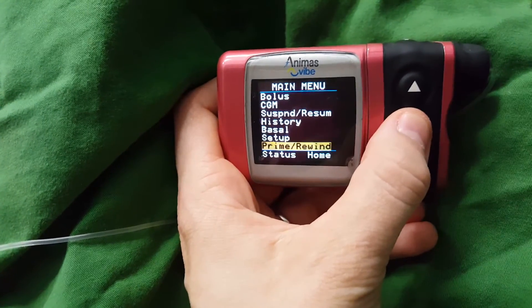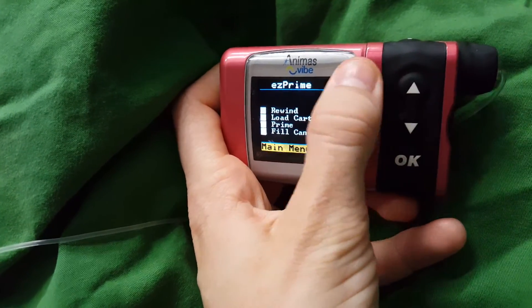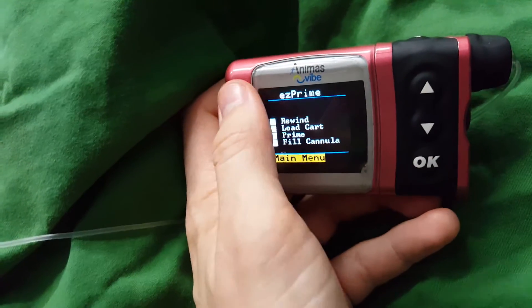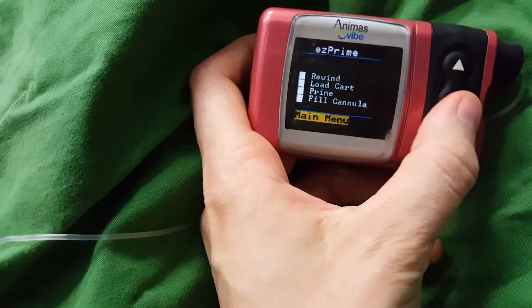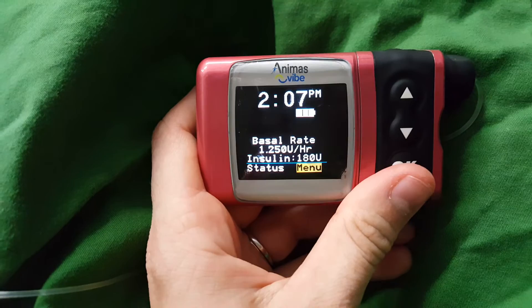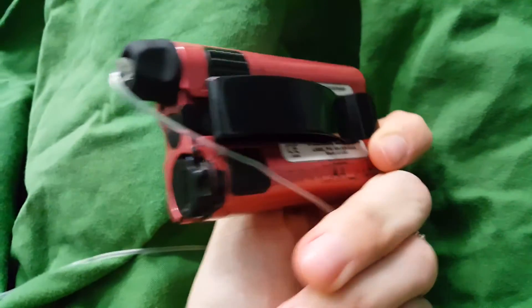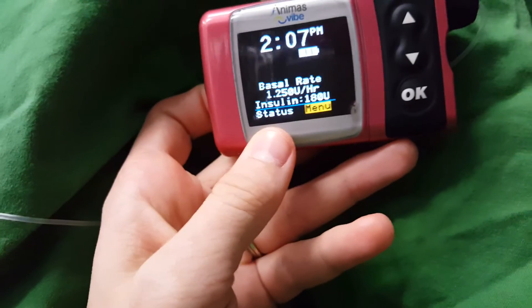You can also go to Prime Rewind — this is where you set the pump up. Rewind will bring the plunger all the way back to the start again. Load cart is once you put the new cartridge in with the insulin, it'll load it up so it meets the base of the cart. Prime is filling the tubing up, and fill cannula is filling the cannula that you put in your body with insulin so it's all ready to go. And that's pretty much a quick — well, maybe not so quick since it's over five minutes — little video of how the Animas Vibe works. It's really, really good. I like it. And mine's in pink. The colour does scratch off a little bit, but yeah, it doesn't really matter too much.